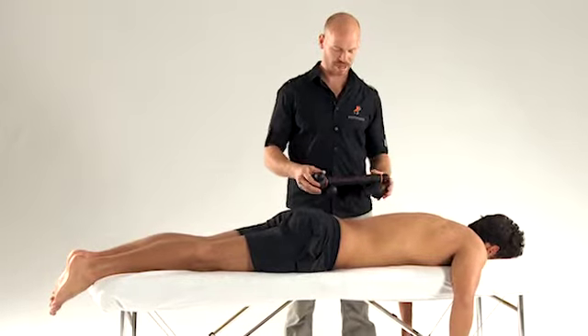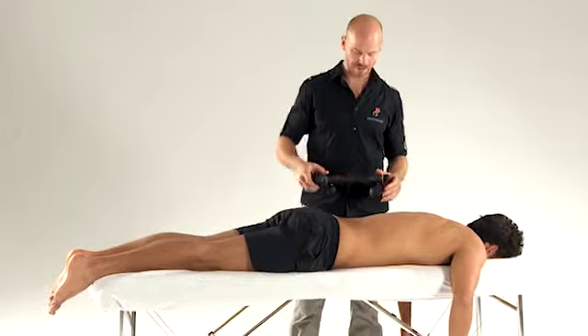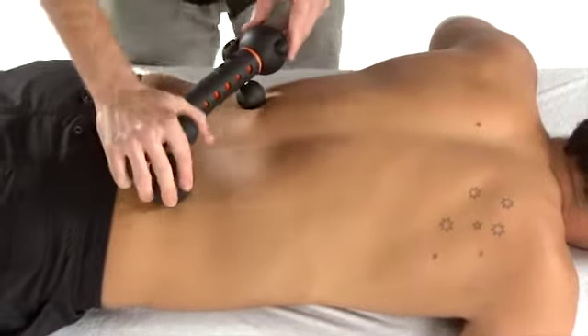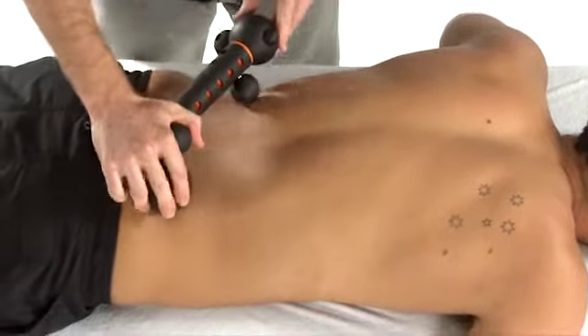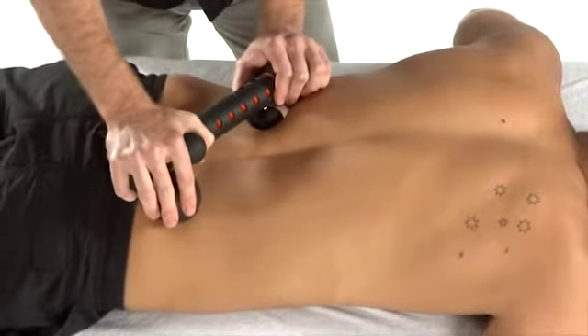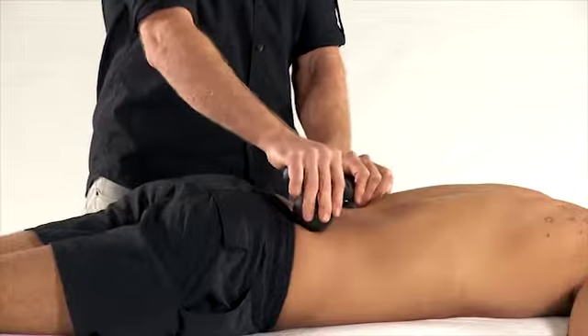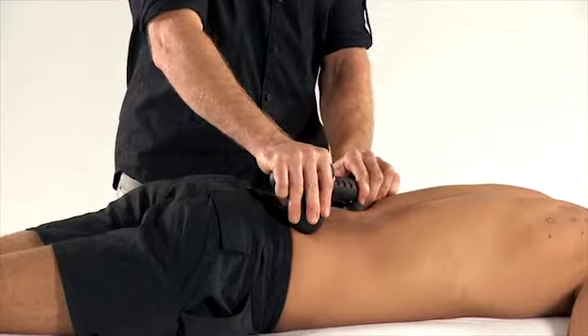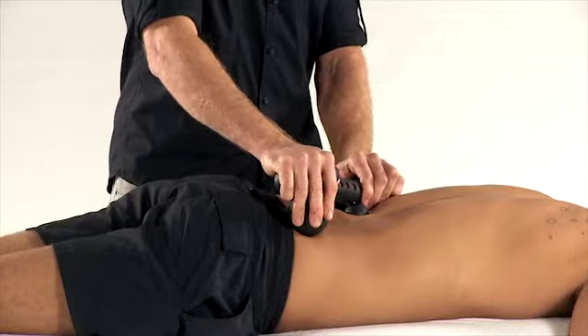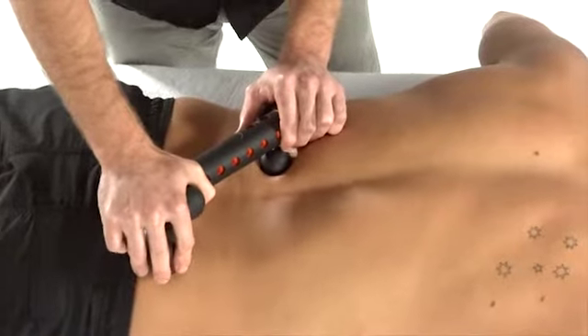The lumbar spine can be treated using the treatment mate by placing the pivot end on the opposite side of the patient, then using the left hand to create the treatment pressure — in this case at the L1-L2 facet joint.